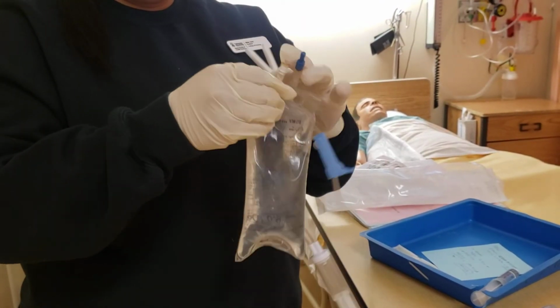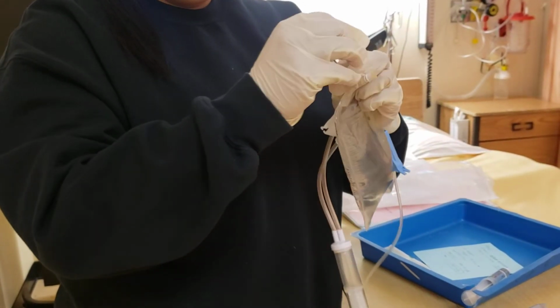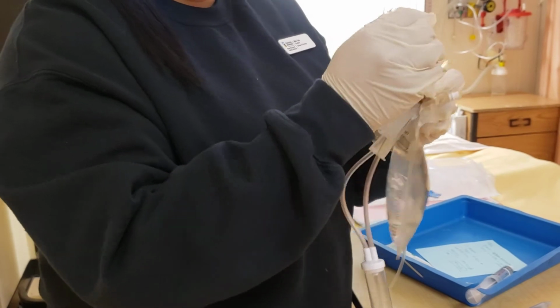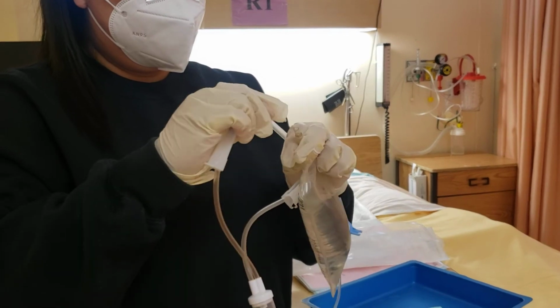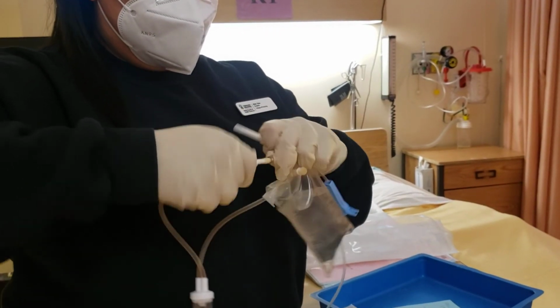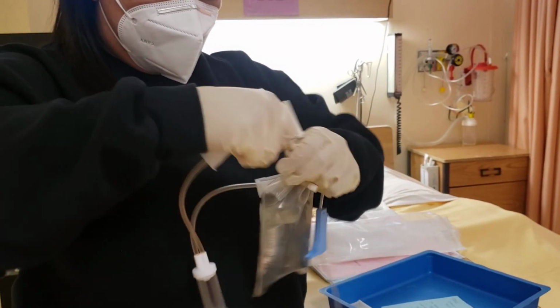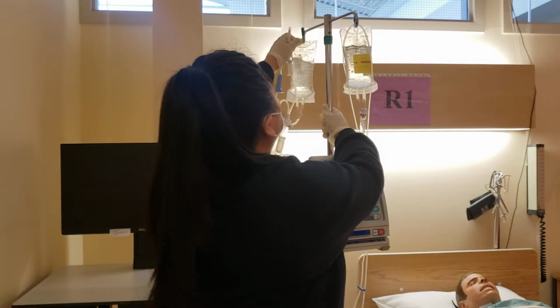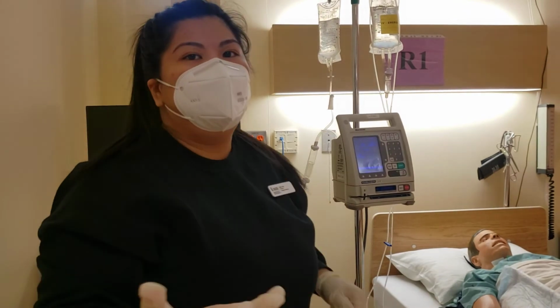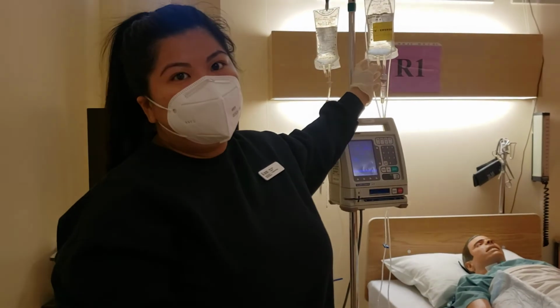I am going to prime my tubing with normal saline to make sure that the blood product doesn't get destroyed when it goes through the filter. So I will spike my bag with normal saline, and have my signature there. We will also be needing another signature there after our second nurse does her check. Also, when we walk into the room, we want to make sure that there is a primed emergency normal saline line that's available in case of any transfusion reaction.